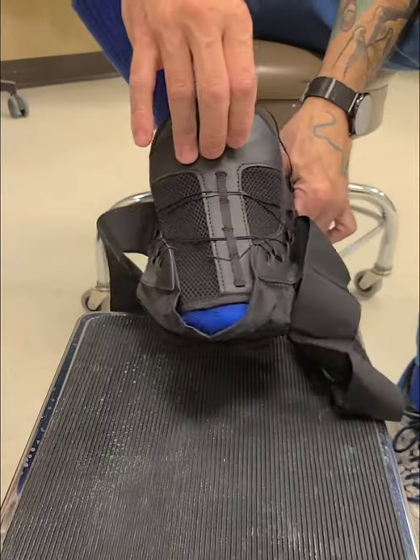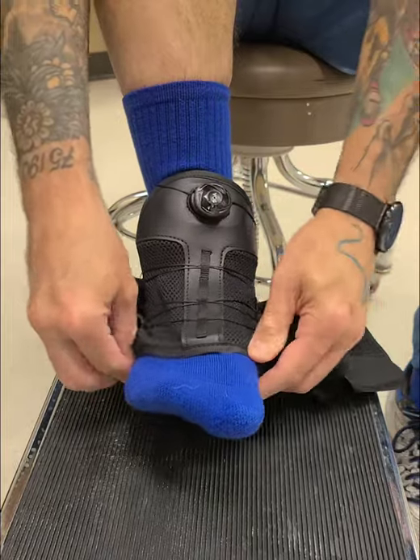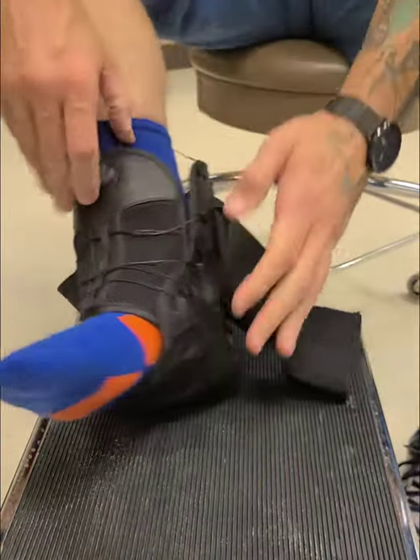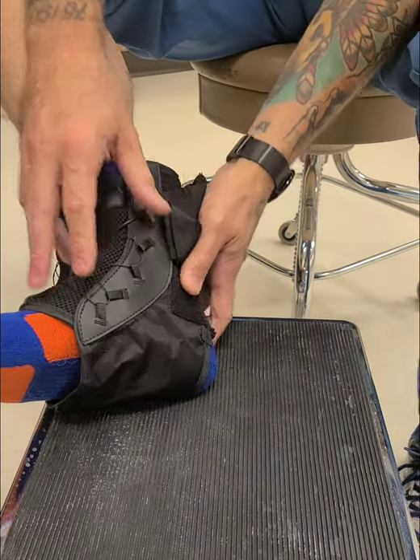We'll put it on like a shoe. Slide our foot through here. We want to get it past that wide part of your toes right here. Once you get it there you scoop it in, and at that point you'll notice there's a heel cup right here to grab your heel so you're in there properly.